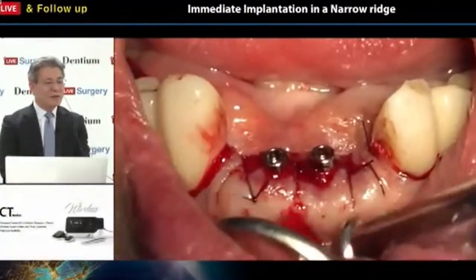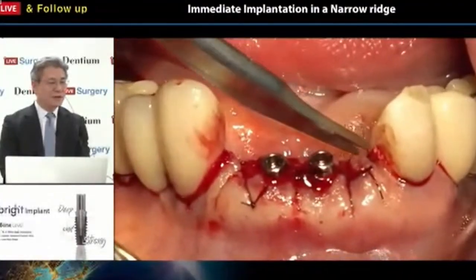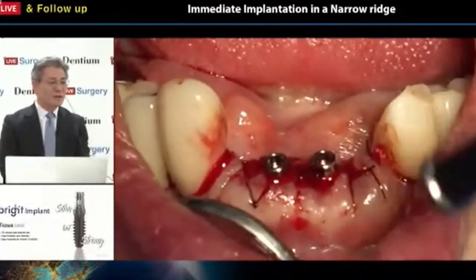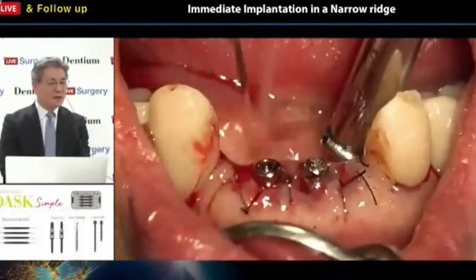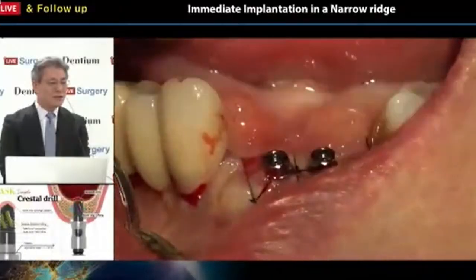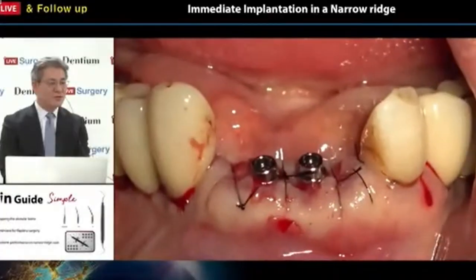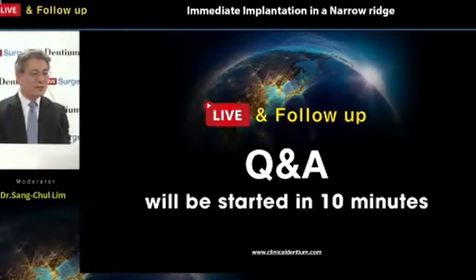Two implants were inserted on the 31, 41 area, and bone grafting was done simultaneously with osteogenocollagen, and the open wound concept healing procedure using collagen graft tool, and the cross suture and horizontal mattress suture, interrupted suture. The simple suturing was done to secure this surgery area. Okay, the surgery was done.